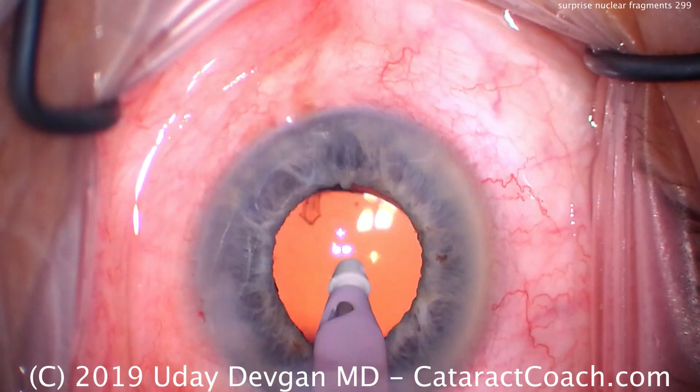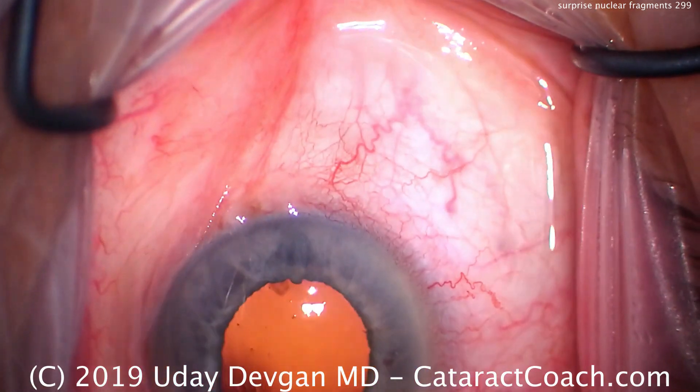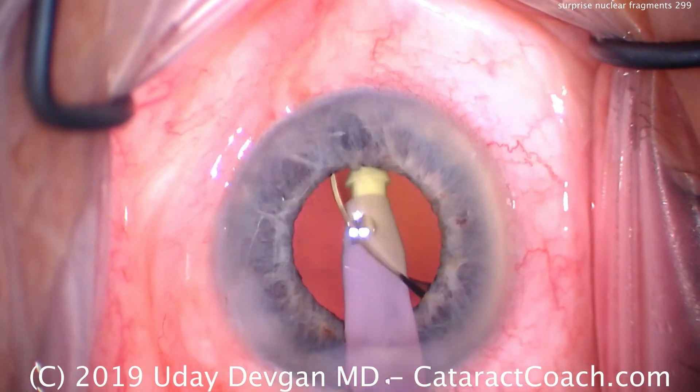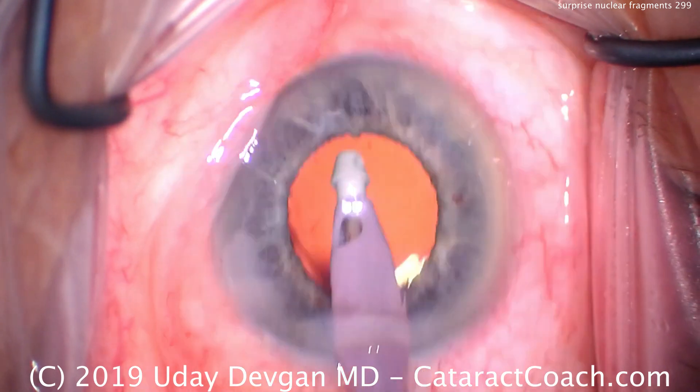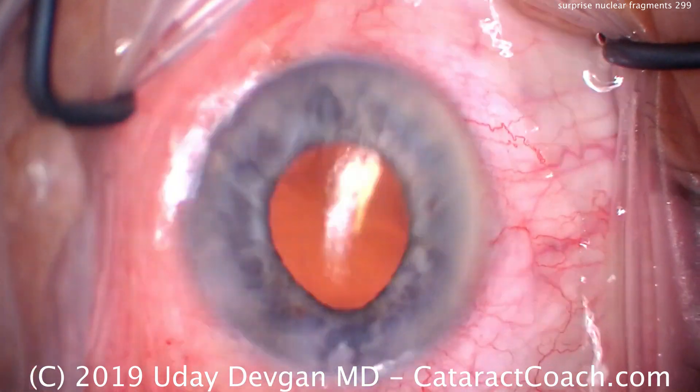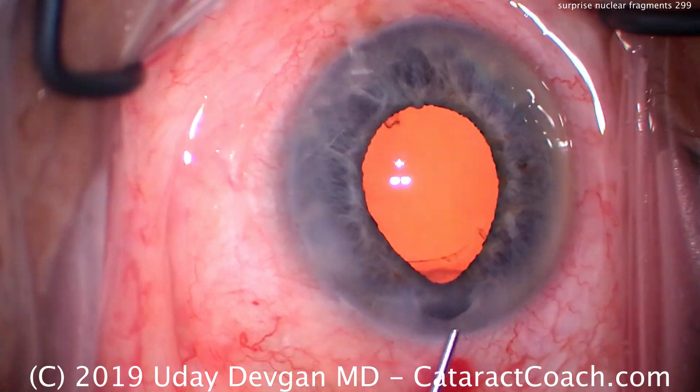How do we get this? Can you leave it in the eye? My advice is don't. The reason is it'll cause a lot of inflammation and could cause capsular fibrosis. You really want to remove it, but I just can't seem to access it quite easily.